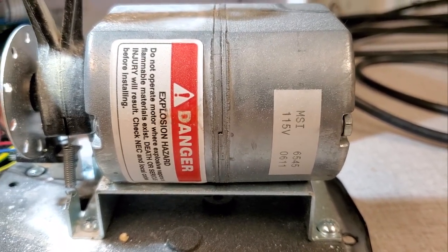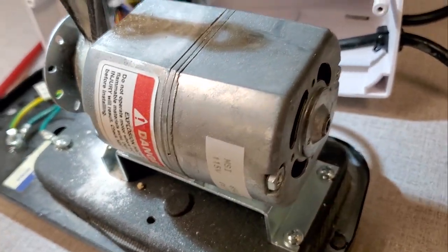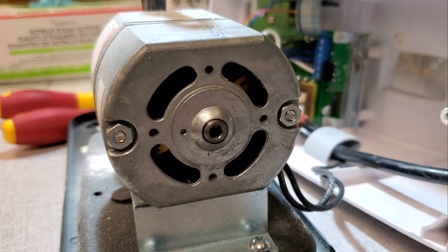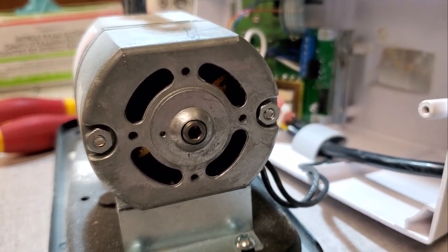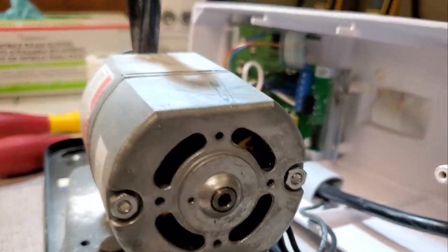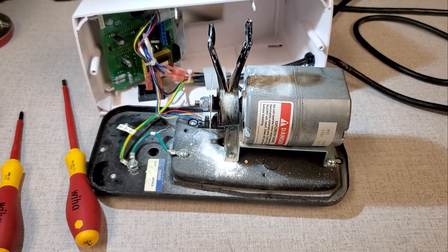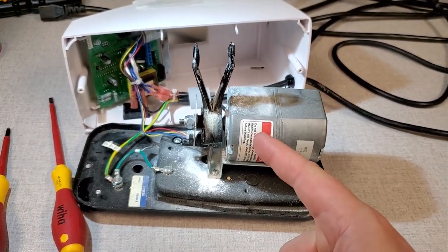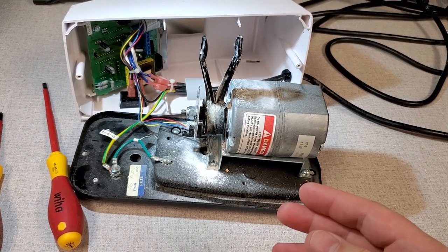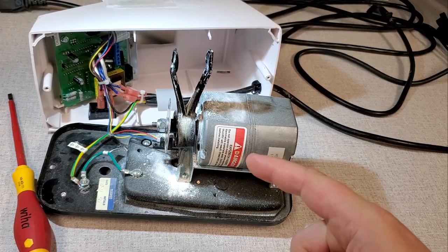This is the motor. And there's some big indicators. This is 115 volt on the outside. But this is called a universal motor. And the reason it's called a universal motor is because down there inside are brushes. You can see up there in the top right and the bottom left, there's brass brush holders. And the reason you call it a universal motor is because it can run on either AC, single phase, or DC if you really wanted to. This one is run off of single phase AC.